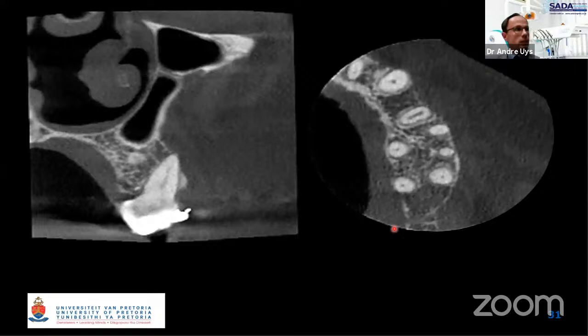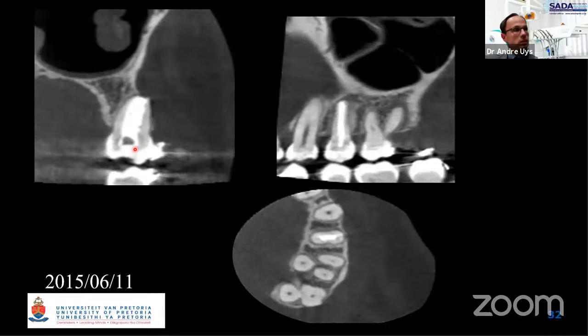The little bony projection that she felt was this mesiobuccal root that was pushed out of the buccal plate. The patient was referred to us for root canal treatment that was completed, as you can see here. Unfortunately, I haven't got any follow-ups on this case, but you can see that this was already 2 years after that initial presentation.